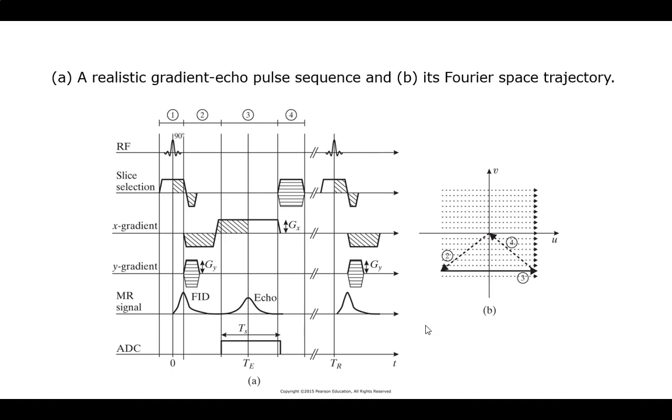So this is the fast forward button to bring it back because it's got to be back here. Otherwise, I'm here when I start the next sequence, right? Which is going to mess things up. So bringing it back as quick as I can, hitting a really strong slice select, speeds everything up, decays it, and then I can start my recovery and just start again.